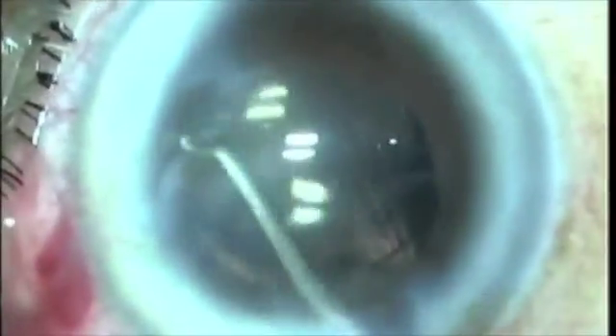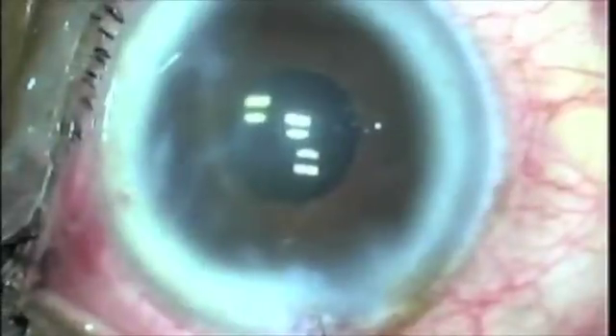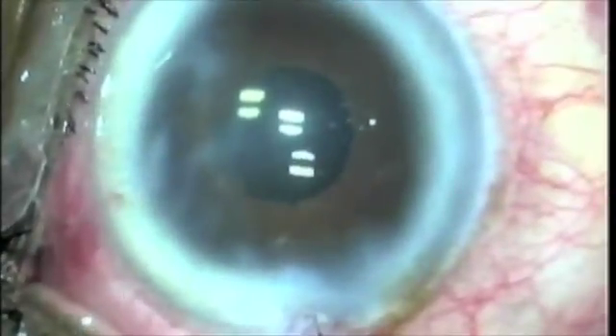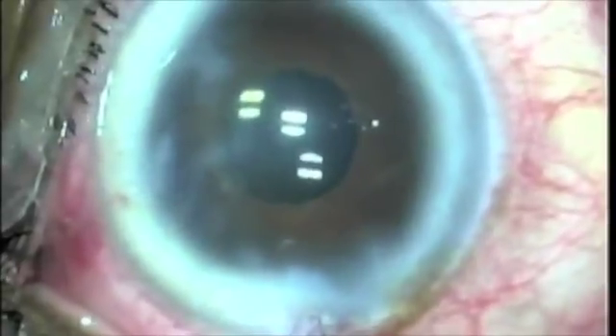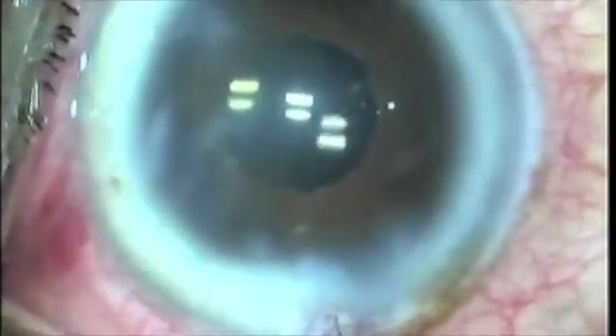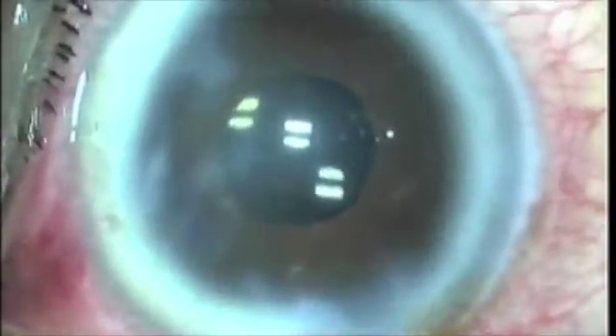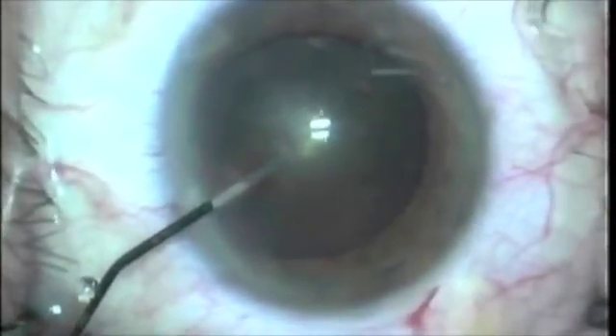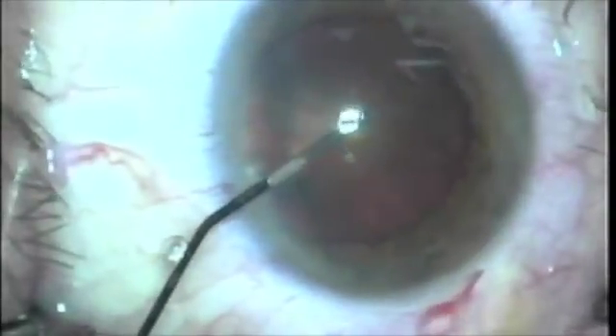Crack it apart. Here you can see the great fixation. You have a large capsule eye, but look at the spring in this IOL. I had told the lady that she would probably need a PK referral to a cornea specialist. As a matter of fact, I put that little suture down there at 6 o'clock. Just around the center, there is a nice clear area and she ended up with 20/50 vision, believe it or not.